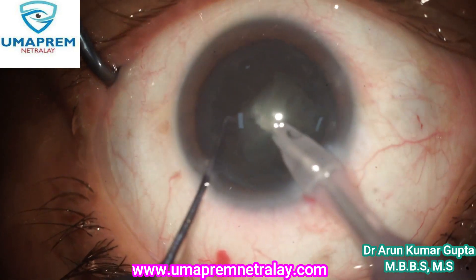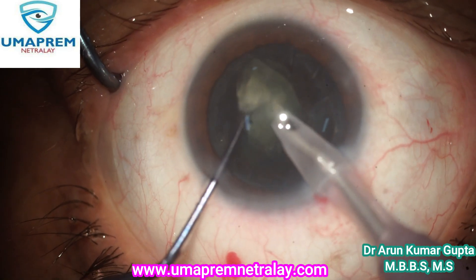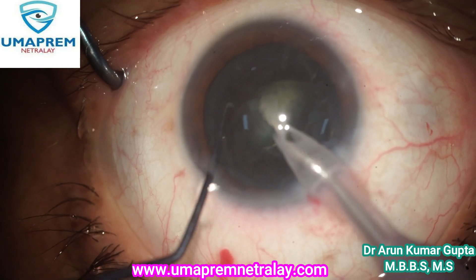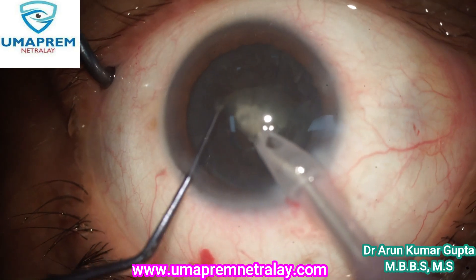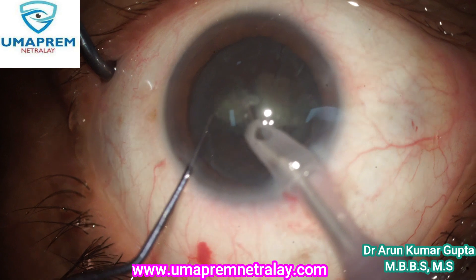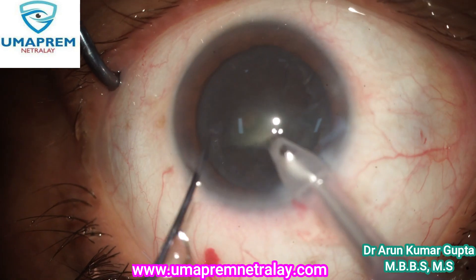See the beauty of this machine — the chamber is rock solid. This is a soft cataract, grade 2 or 3, not too hard, and it is easily emulsified.